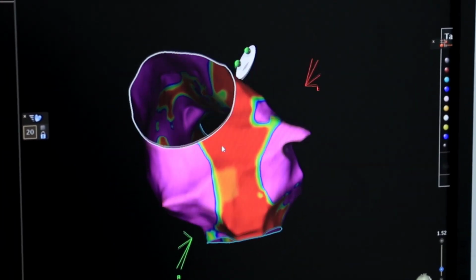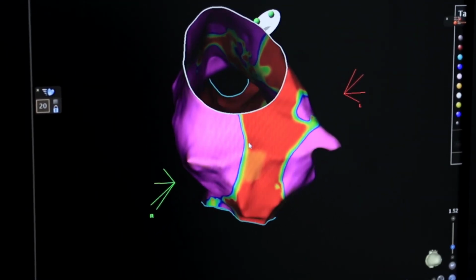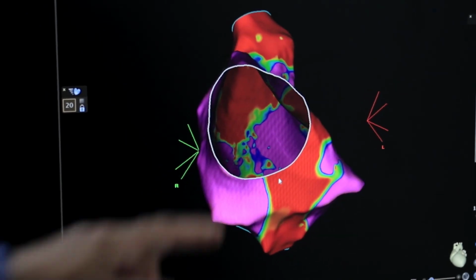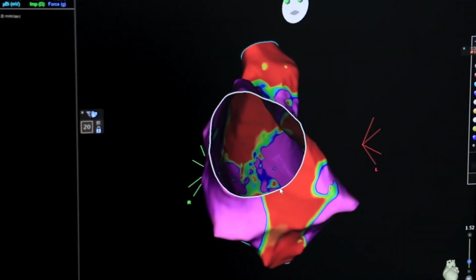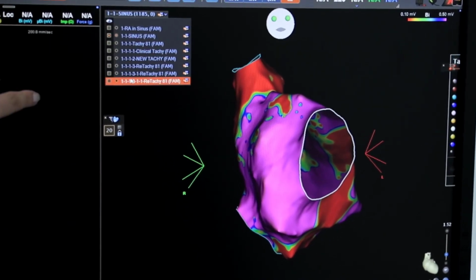Clearly, look at this, somebody has been working here. That was 2008. But the gap was here. Apparently it was at the annulus. We found it later on, that's part of the weakest part, in the last map.